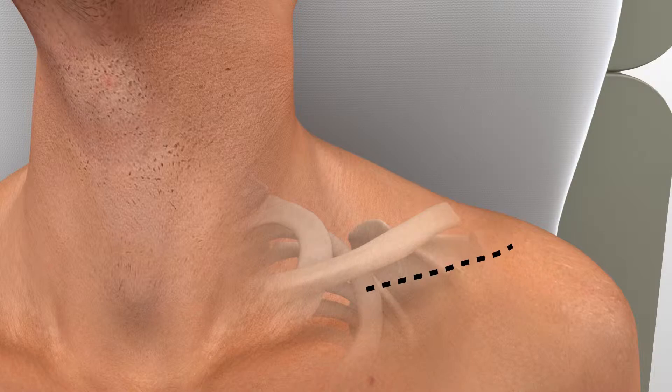The deltotrapezial fascia is sharply incised along the clavicle, and the subperiosteal flaps are raised and protected for future deltotrapezial fascia repair.